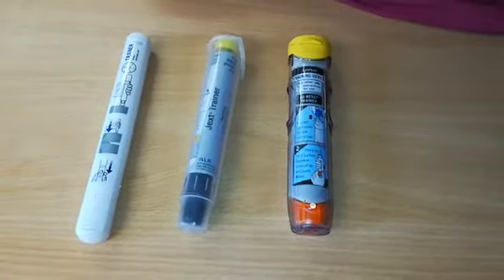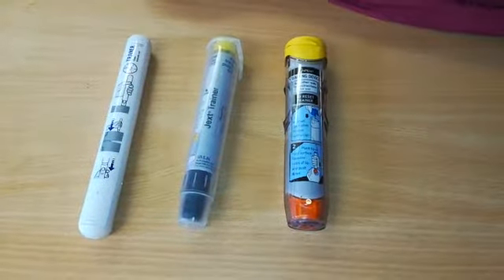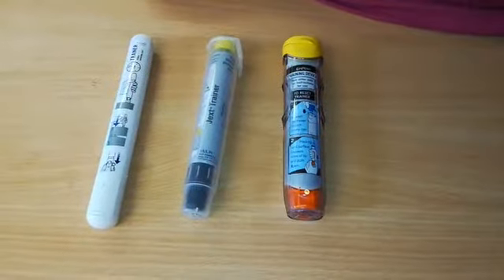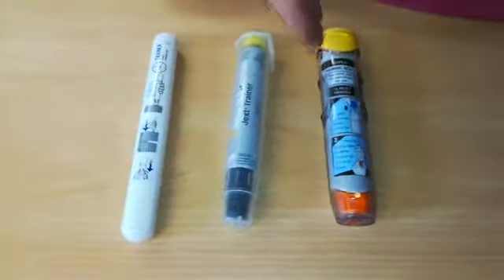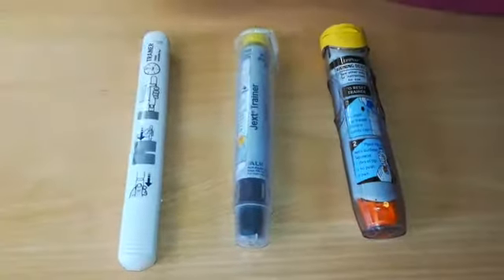In this video, we're going to start talking about our adrenaline auto-injector for anaphylaxis. As you can see, the three different types we mainly use within the UK are the EpiPen, the Jext trainer, and the Emerade trainer.